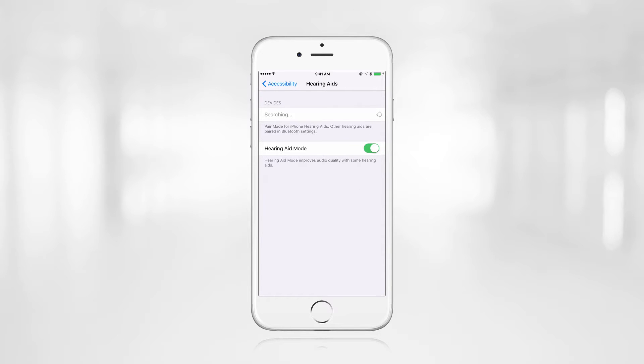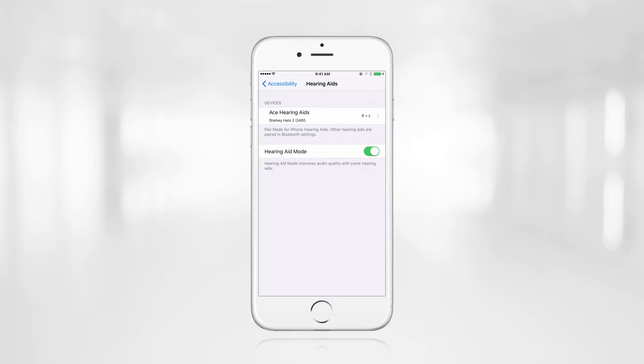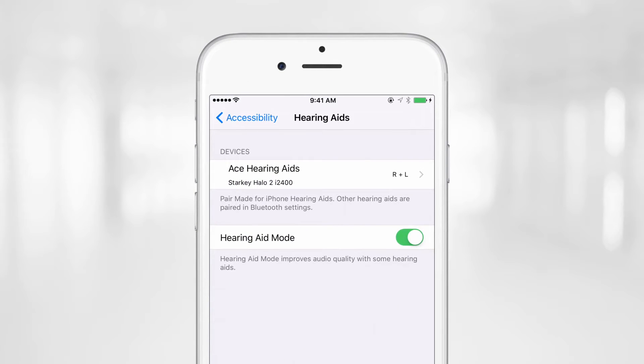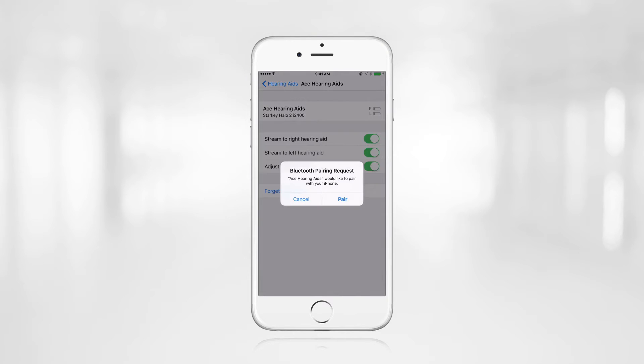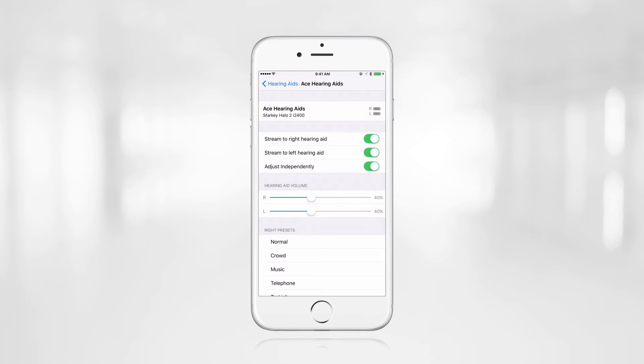The iPhone will begin searching for the Halo devices. Once the hearing aids have been discovered, they will display on the iPhone screen. The hearing aids will be identified using the patient's first name, followed by the words Hearing Aids. Tap on the hearing aid name and a pair prompt will pop up. Simply click on Pair to wirelessly connect the hearing aids to the iPhone. This pair prompt will appear twice, once for each hearing aid. Now the Halo devices are connected to the iPhone and are ready to be used with the TruLink app. It's as simple as that.